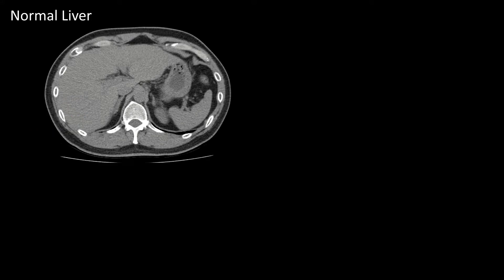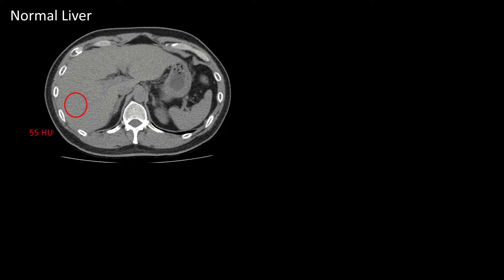When you're looking at the background liver on CT, the two most common abnormalities you will see in clinical practice are fatty liver disease — aka diffuse hepatic steatosis — and cirrhosis. These are also things you want to accurately diagnose, so we're going to spend most of our time on these. This is a normal liver on non-contrast acquisition. Background liver has a normal attenuation, most commonly in the 55 to 65 Hounsfield units range — here it's about 55 HU.